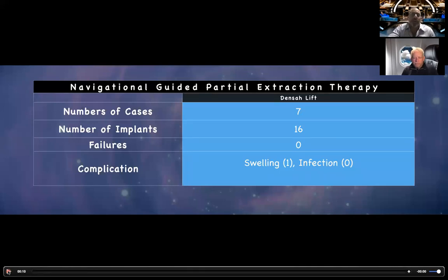On those cases, we planned a crown. We scanned the patient, we made a virtual wax-up and imported it. Now we don't have to do that. Now the crowns are there. You just select the crown, change the dimensions. We can bring it into occlusion if we want. We can figure out where we're going and deliver it in a prosthetically driven fashion. And we can even go ahead and make final or temporary abutments. My latest thing is that I have a case set up for a final abutment.